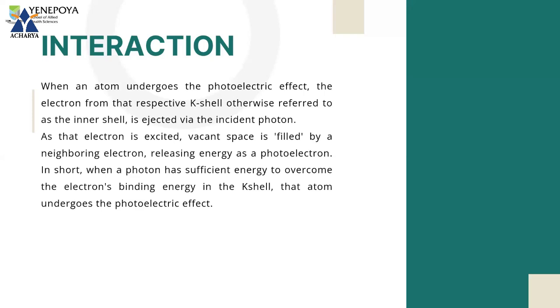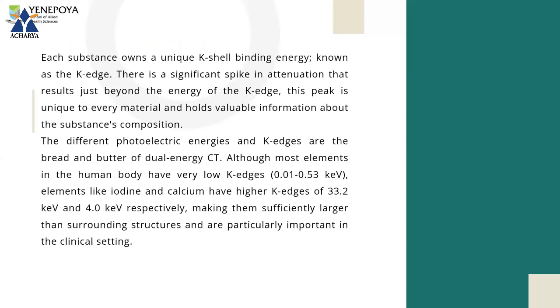This whole phenomenon is called the photoelectric effect, and the energy required to overcome the K shell binding energy is known as the K-edge.